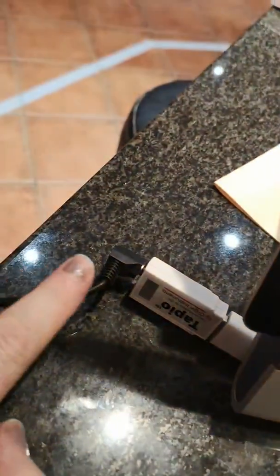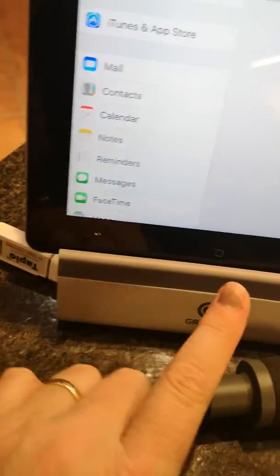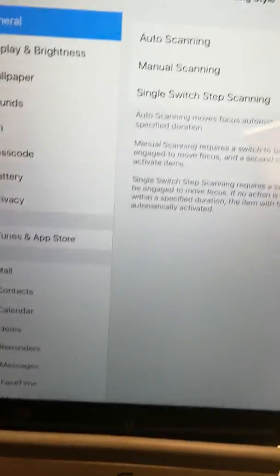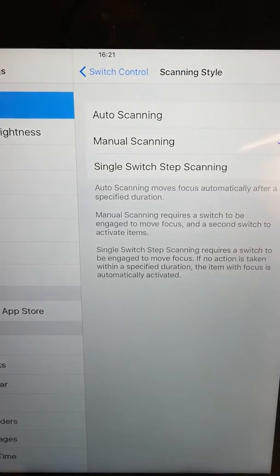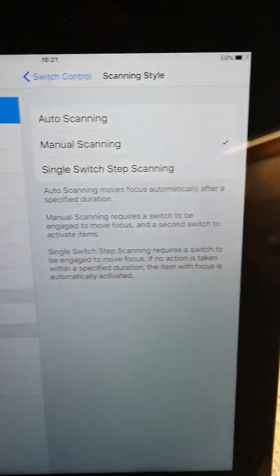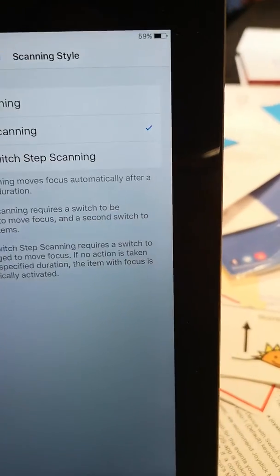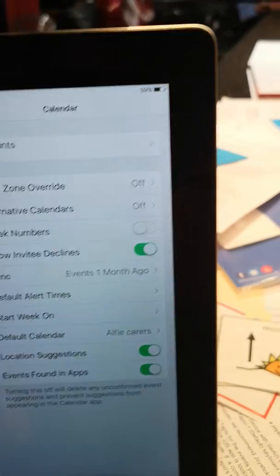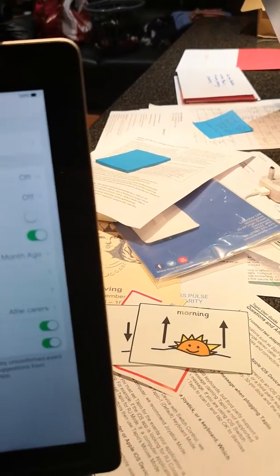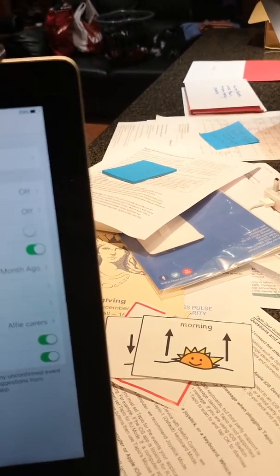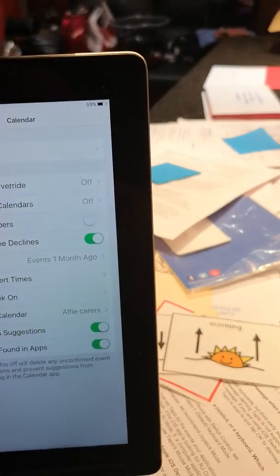So the switch is plugged into the Tapio and the Tapio is plugged into the iPad. I put the scanning style on to manual and what else have I done? Where have I gone into now?